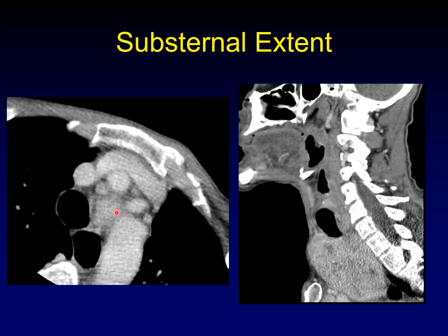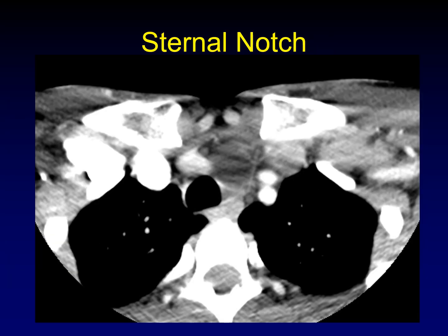Here's another example — I would say there is substernal extent to the level of the origin of the great vessels. A sagittal reconstruction can be helpful to show the lower extent of the lesion and give anatomic reference points. What if a mass extends between the heads of the clavicles but not quite underneath the manubrium sterni? That is not substernal extent — I need to see the manubrium sterni on the same cut as the mass. In that situation, I'll say the mass extends into the sternal notch, but I'm not going to say there is substernal extension.